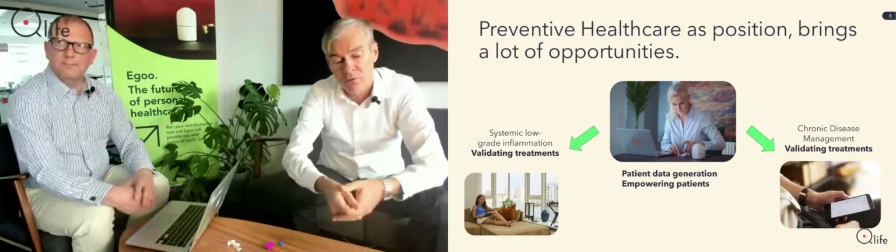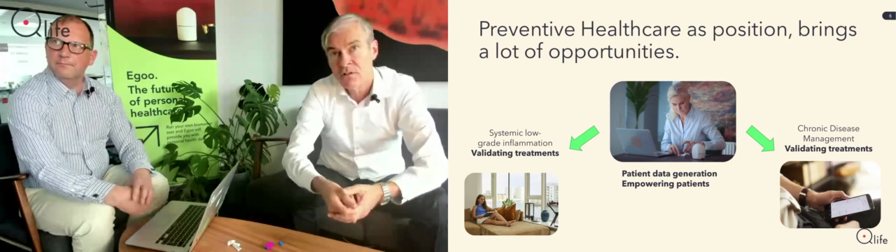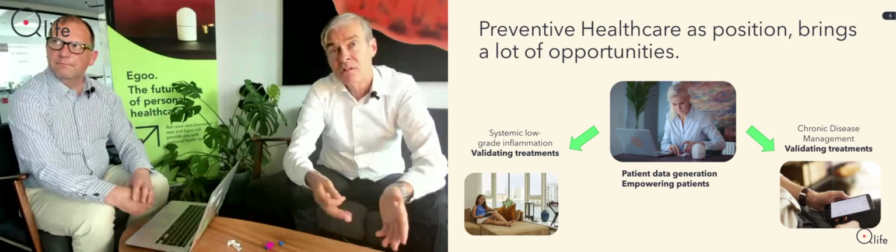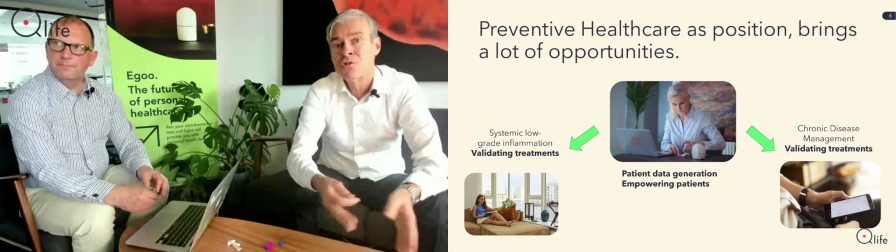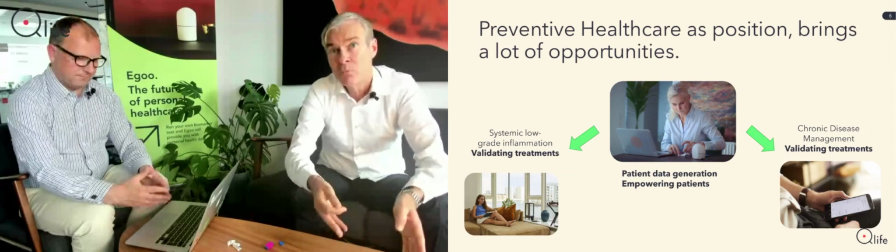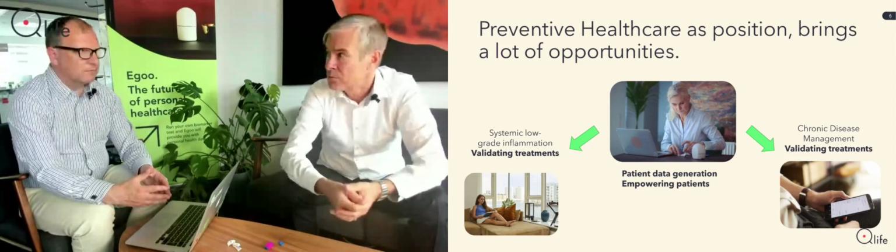So in other words, when a physiotherapist is doing their treatment, you can validate with a blood biomarker to see if it's actually working, because if it's working, your inflammation level should be decreasing.